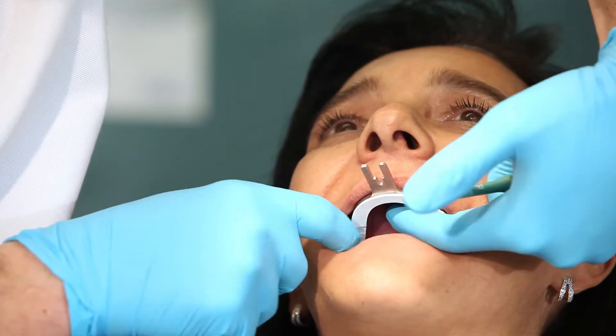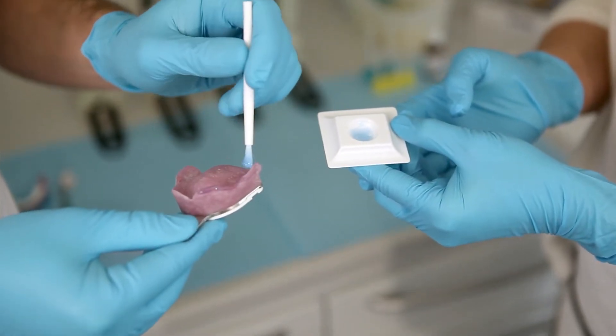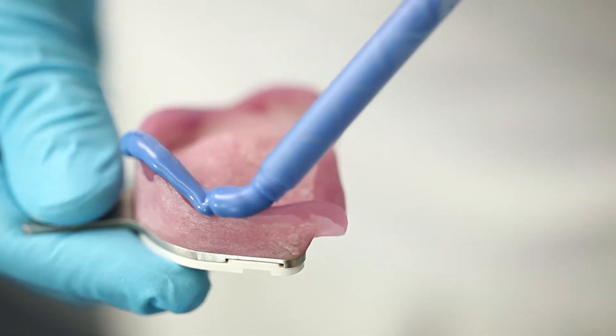To shape the functional margin in the upper jaw, thoroughly rinse the tray and dry it. Apply a suitable adhesive around its circumference. On the prepared margins, apply virtual heavy body and carefully rotate the impression tray into the mouth.